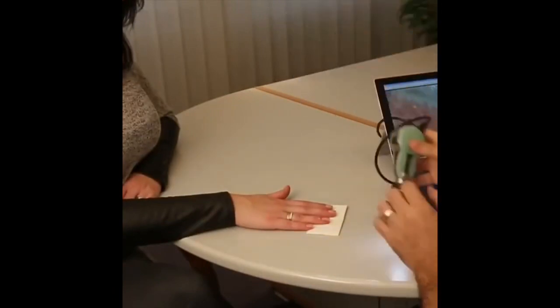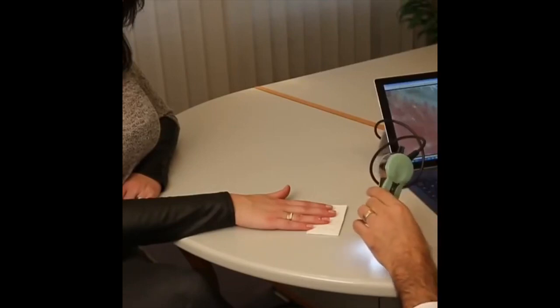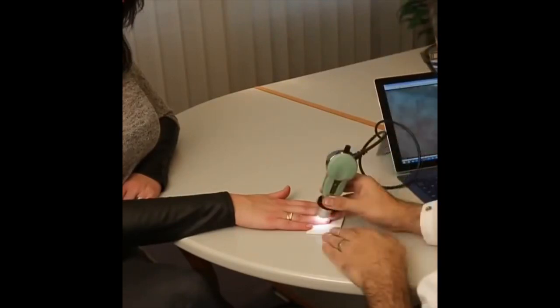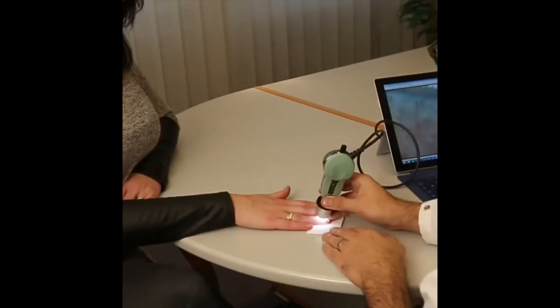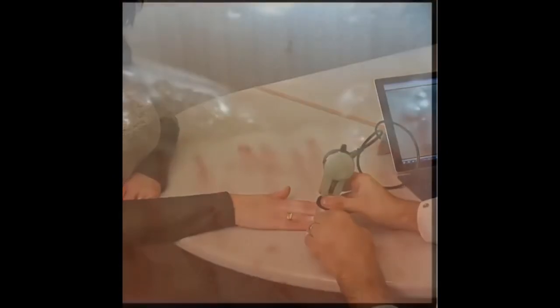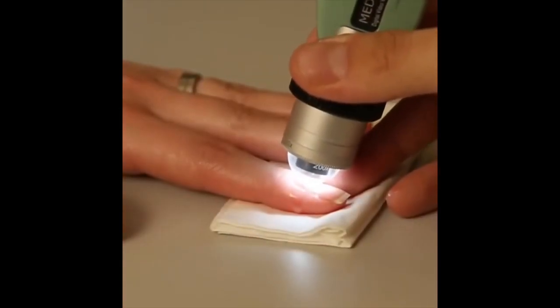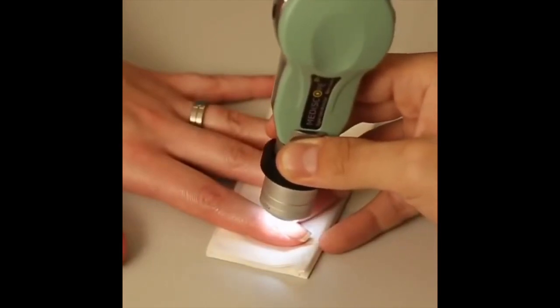The nail fold capillaroscope is a non-invasive handheld digital microscope with an inbuilt LED, which we place over the junction between where the nail ends and the skin starts. As you can see, the skin here is very transparent, and as we focus on it with computer-based software, we can easily visualize the capillaries there.